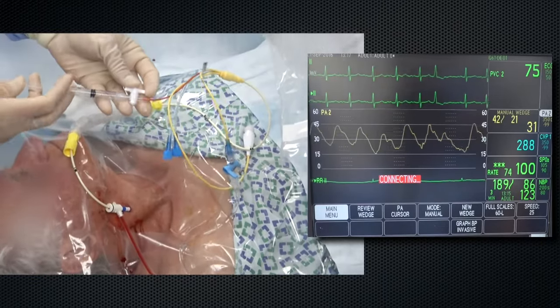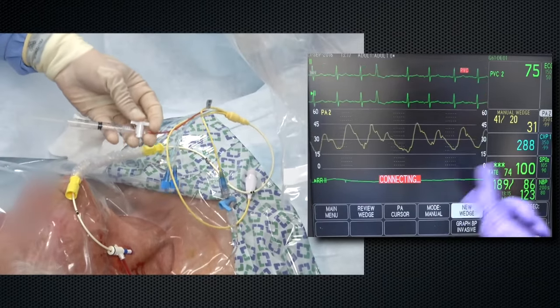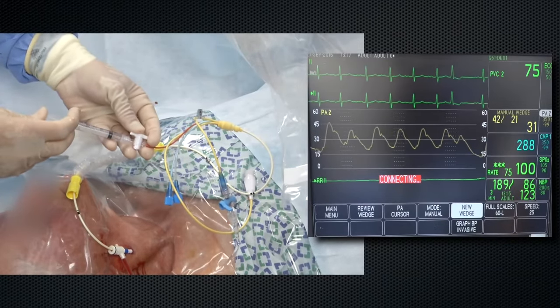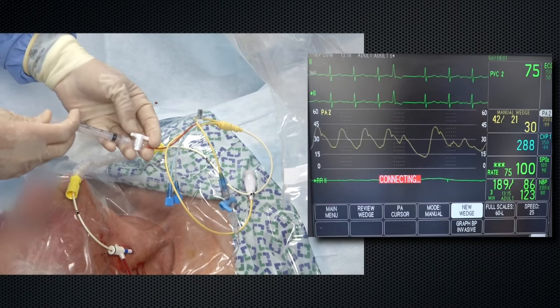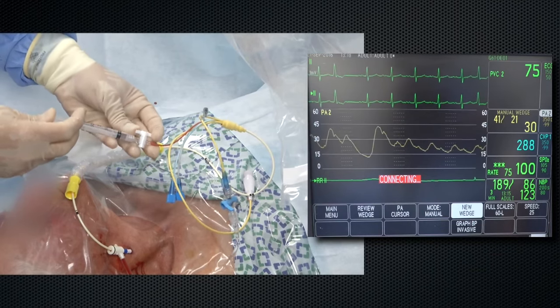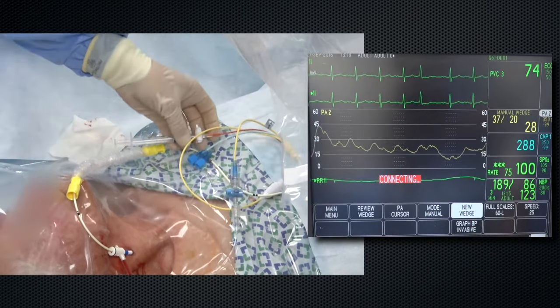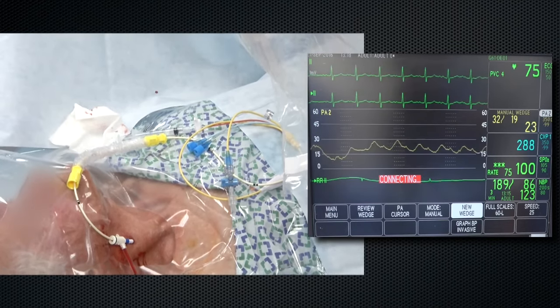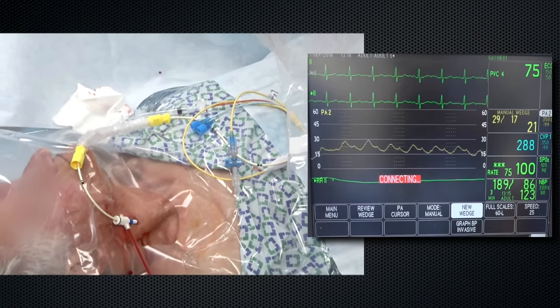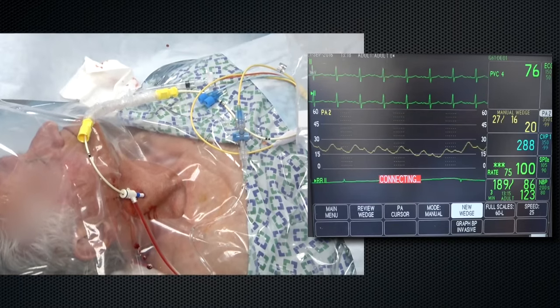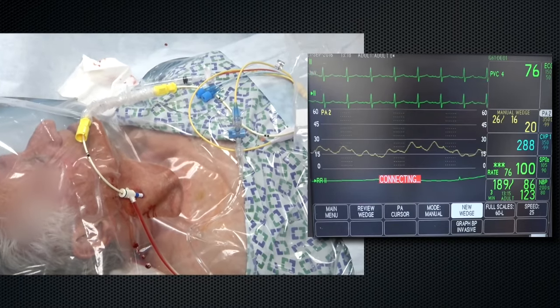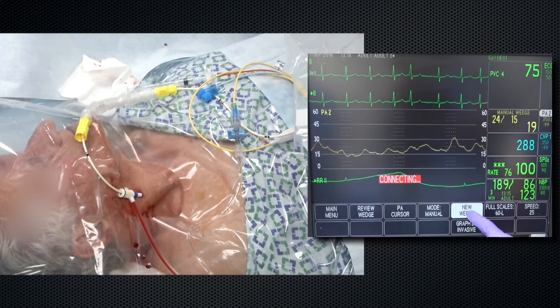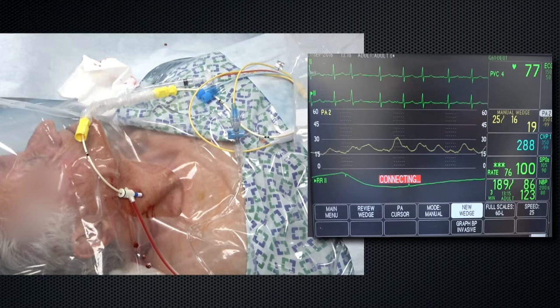Then, slowly inflate the balloon while observing the monitor. As the balloon inflates, the peaks and troughs of the PA waveform should transition to represent a tracing consistent with a wedged waveform. Catheters may migrate distally after initial placement. Therefore, take caution to inflate the balloon slowly and only inflate with enough air to obtain a satisfactorily wedged waveform. Overinflation of the balloon may cause pulmonary artery rupture.